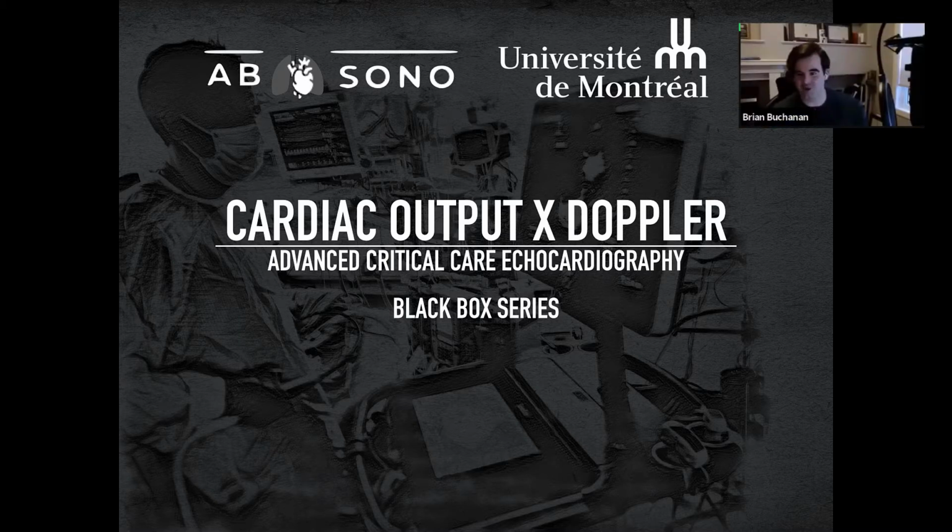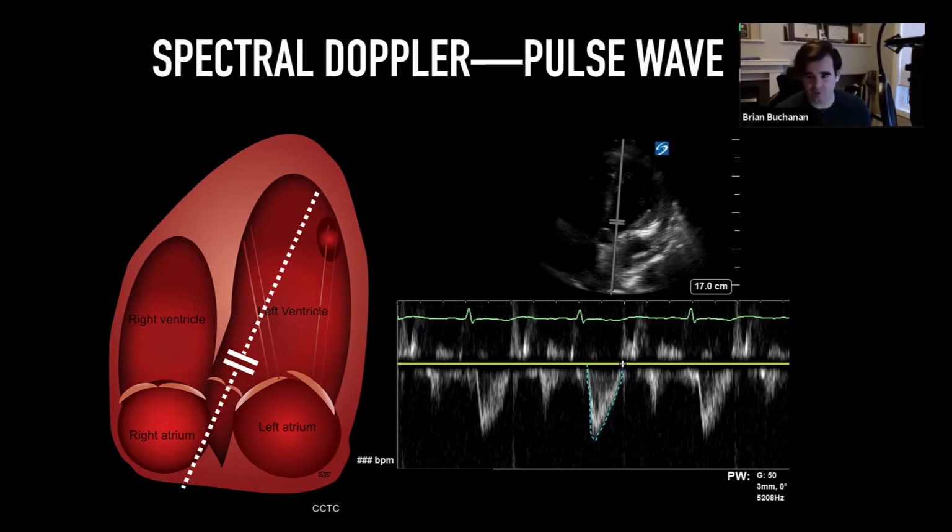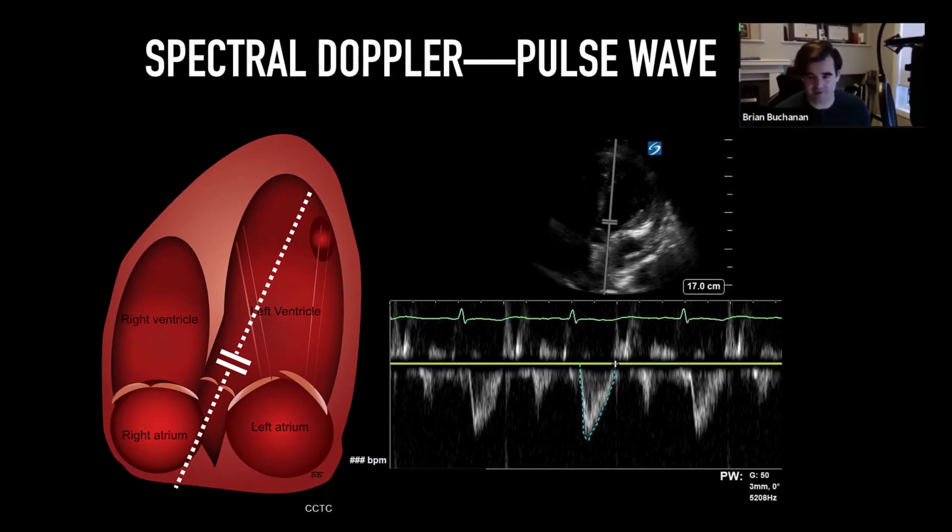There we go. Excellent. So we were chatting about having another black box discussion because we felt like this topic in particular was one that is really beneficial, but also kind of mired in some complexity here and there. So our target audience really is those people who are honing their skills as more advanced critical care or acute care echocardiographers. Hopefully, a broad overview of this spectral Doppler technique with a very specific focus on the use of pulse wave Doppler as our modality of choice.